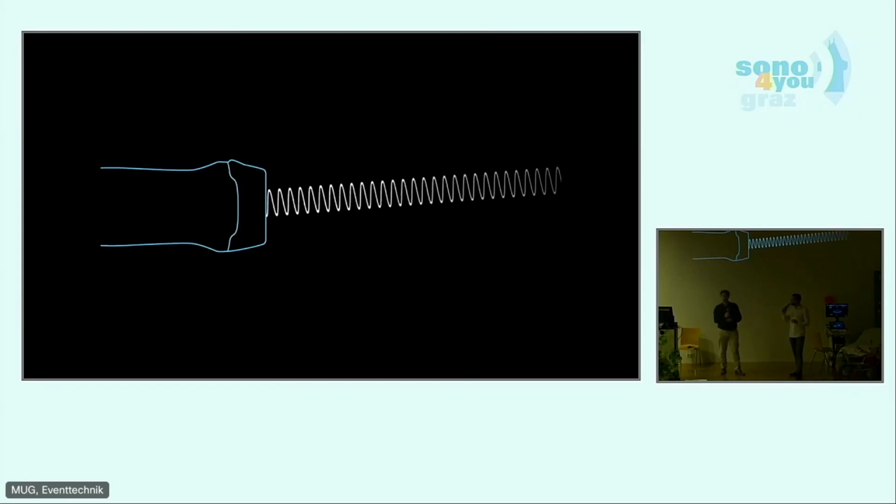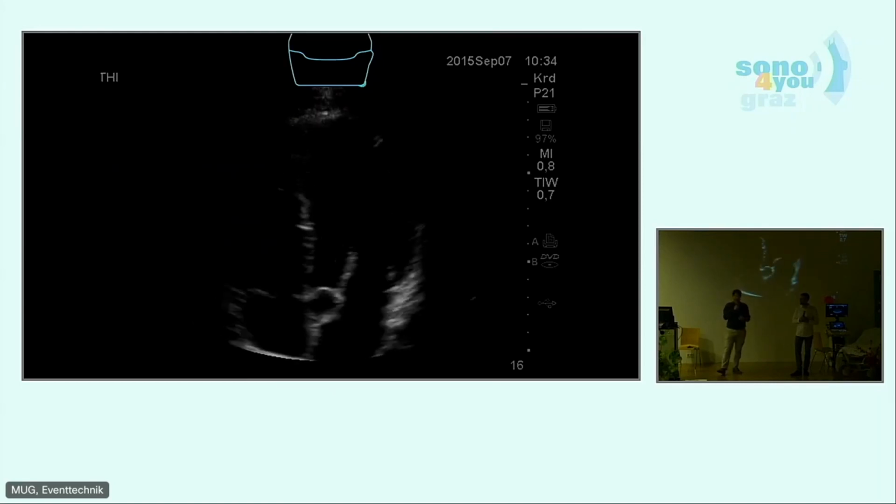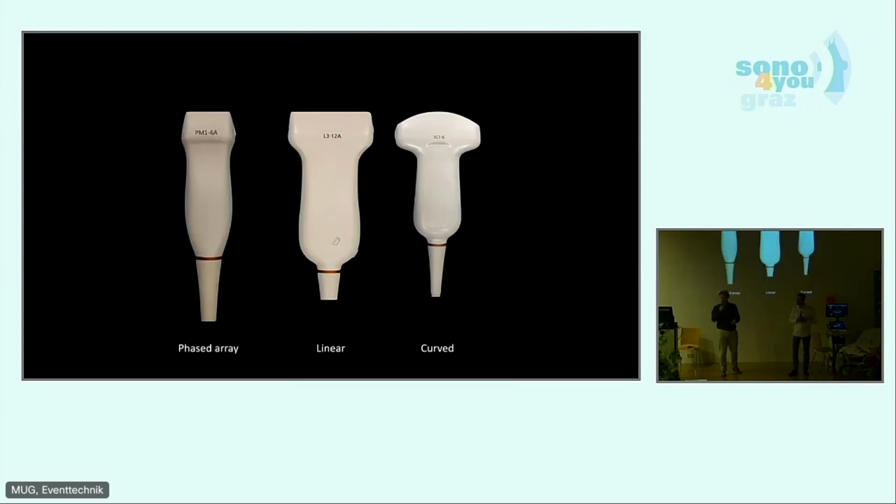Small contact surface, big image. Well, I guess the rib cage can be quite an obstacle. Exactly, because we can't scan through the ribs. We need to take an intercostal space. We need a small contact area, but we want to see the whole heart, right? This is why we're using the phased array. On this picture, you can see how these probes look in real life, but I think you will get to know them over the next days, actually today.